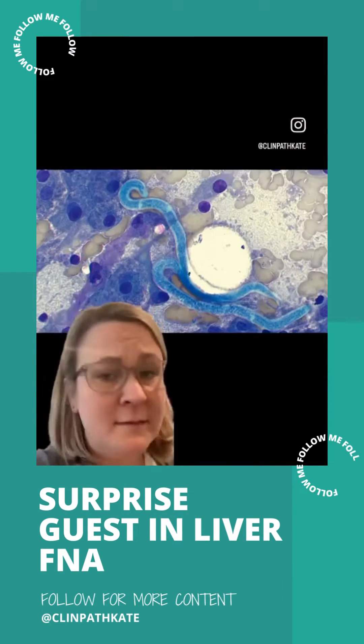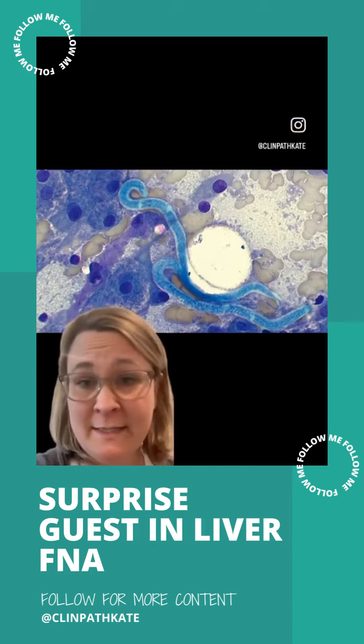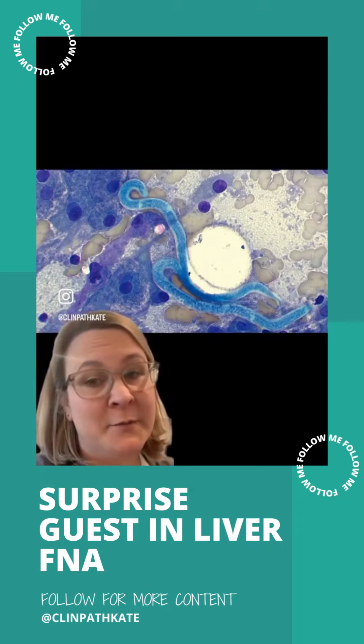So let's talk about this fun find. This was a liver aspirate from a dog who had hepatomegaly, and they were wanting to see if they could figure out what was going on and why this dog's liver was large. They went ahead and did an aspirate, and that's what we're looking at here.